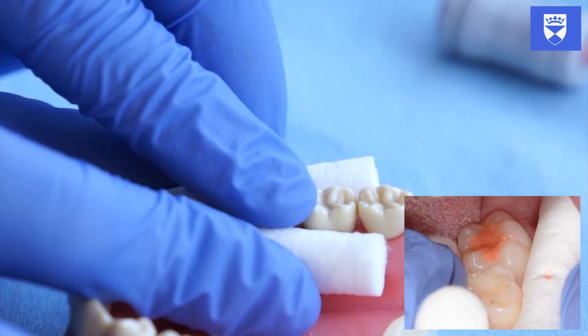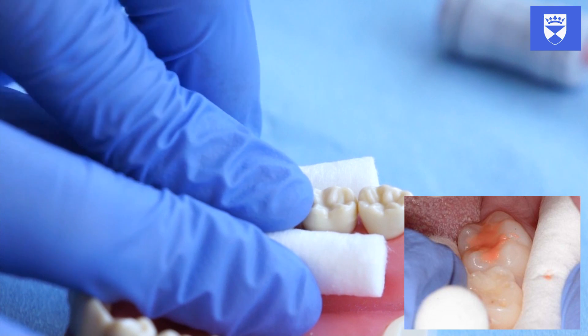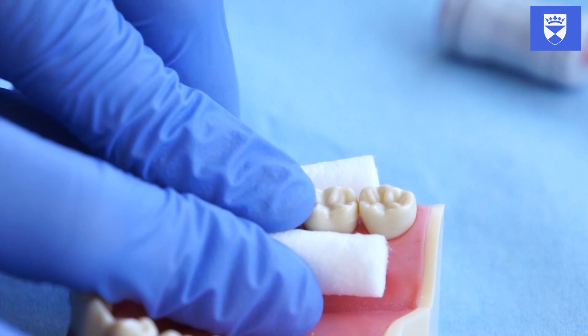It must be noted that glass ionomer sets quickly. Any shaping that you intend to carry out must be undertaken within the first few seconds of placement.